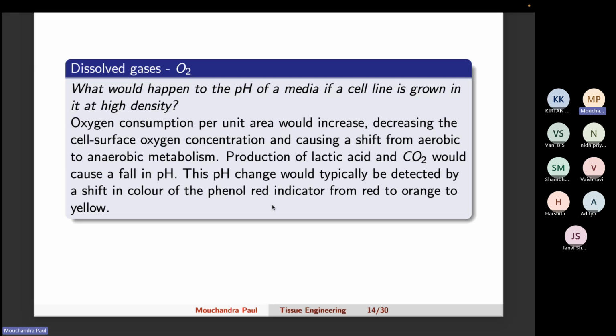And at this acidic pH, the cells will not be able to grow. They will start coming out and floating in the media, meaning the adherent capacity will be lost slowly. The morphology of the cell will become abnormal, and the more you will see, cells are dying. So whenever you see floating cells under the microscope in the cell culture flask, we usually associate that these cells are dead. Dead cells can't adhere, and morphology starts changing.